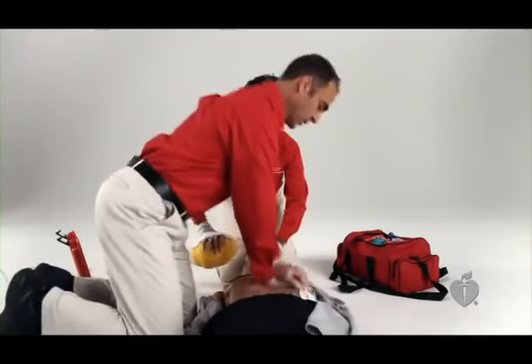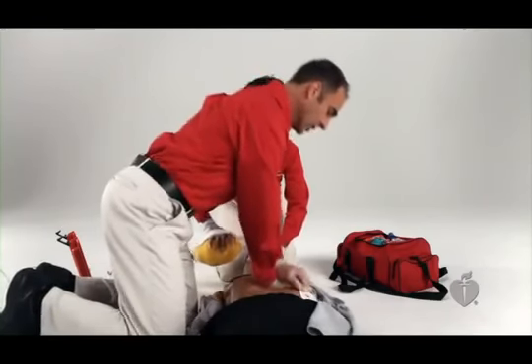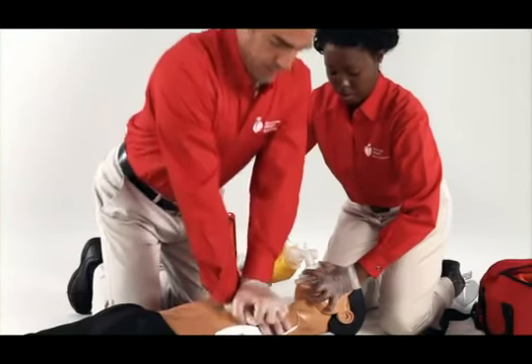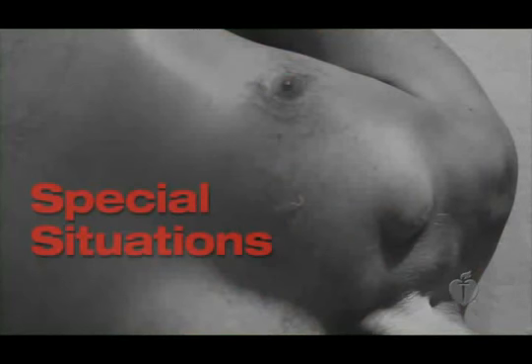Do not remove the AED or turn it off. The AED will repeat the analyze and shock cycle every 2 minutes. No shock needed. When the AED indicates no shock advised, you do not check the pulse first, you immediately start chest compressions again. There are also some special situations you'll need to consider when using an AED.